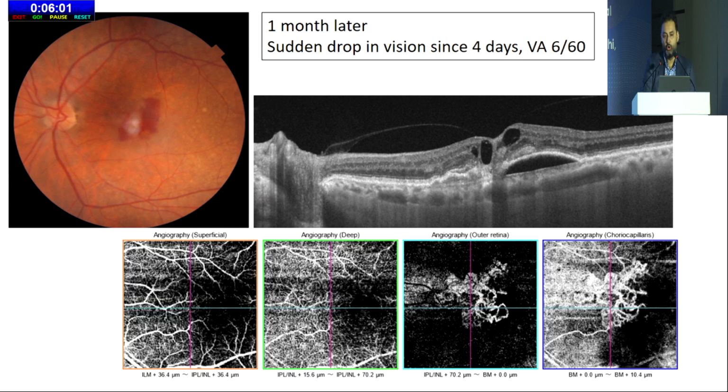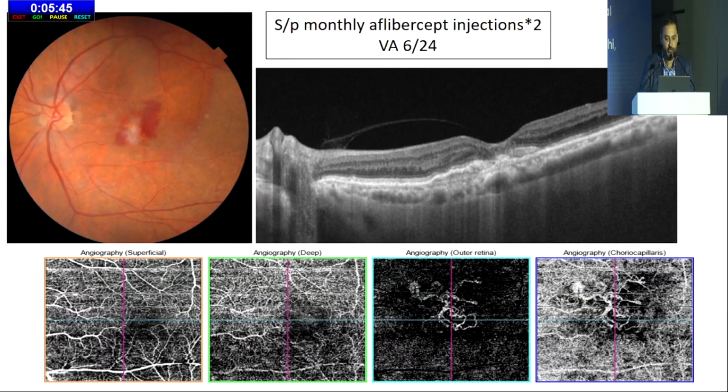This patient now has almost all the telltale features of wet exudative AMD, with clinically detectable submacular hemorrhage, subretinal fluid, and intraretinal fluid. You can see those two separate membranes have now bunched up together and formed the typical Medusa head kind of appearance. It was managed with monthly aflibercept injection. This is a recent follow-up, and it has actually gone down to that.